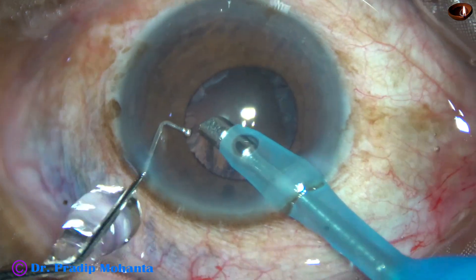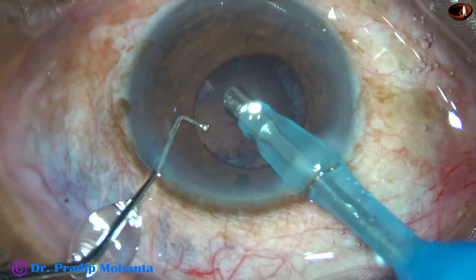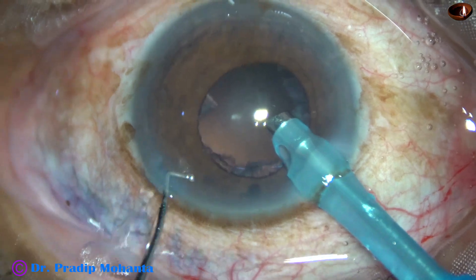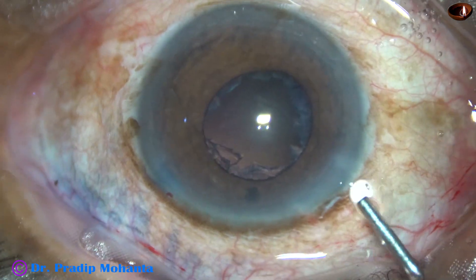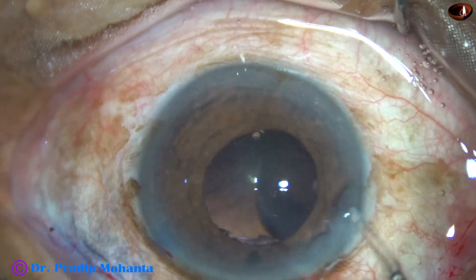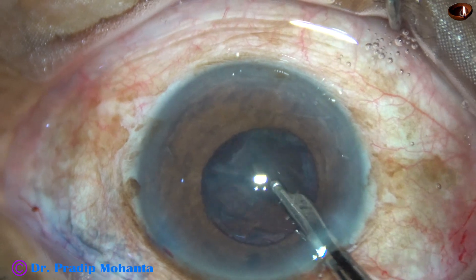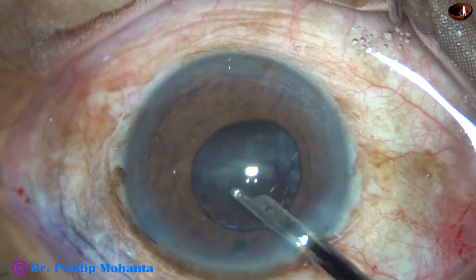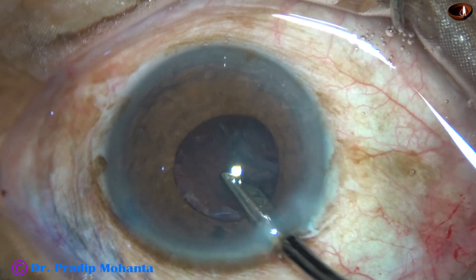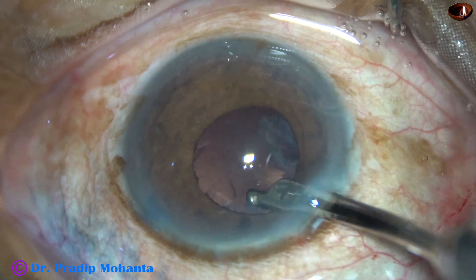Yes, the nucleus has come out. This is a layer of epinucleus. Now my plan is to remove the epinucleus by a 23-gauge Simcoe cannula. Here it goes. It is coming out gradually.